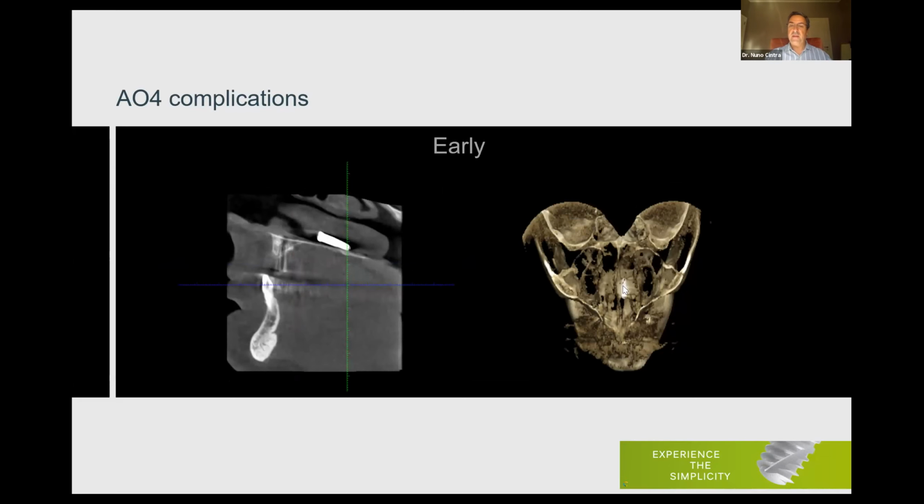There it is, quite in a back position. So, I don't like to interfere with other specialties, mainly ENT surgeons or ophthalmic surgeons. I don't like to go to their field. But here we are at the limit. This is my field, this is maxilla, and this is the nasal floor of the nose. So I'm on the limit. So my idea was to open a small window through the palate, reach the implant, and push it forward. So I decided to do so.